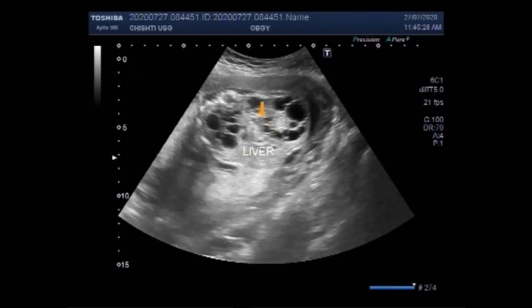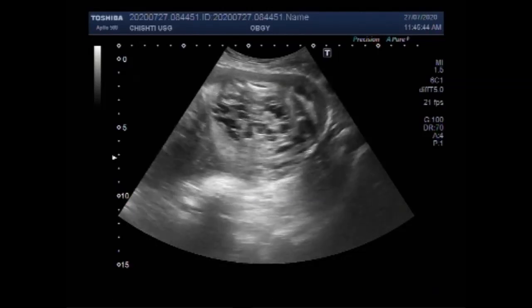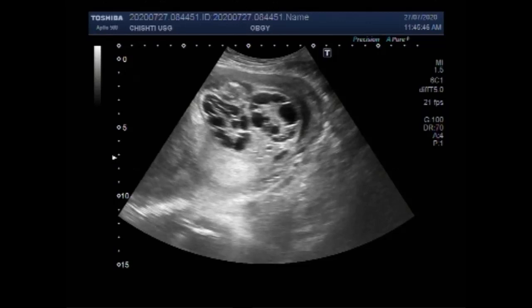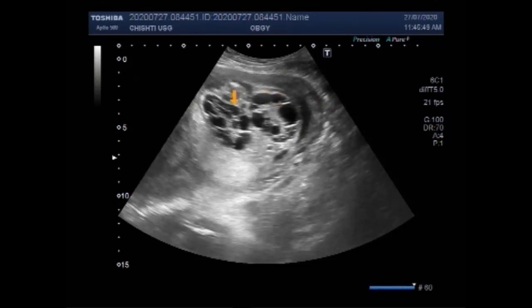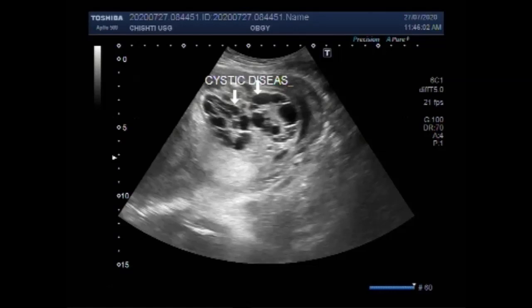Another thing you must have noticed is that in this fetus there is a lack of amniotic fluid — the amniotic fluid is very scanty. This is called oligohydramnios, which is a low level of amniotic fluid during pregnancy. It is defined by an amniotic fluid index below the fifth centile for gestational age, and it is thought to affect approximately 4.5% of term pregnancies.